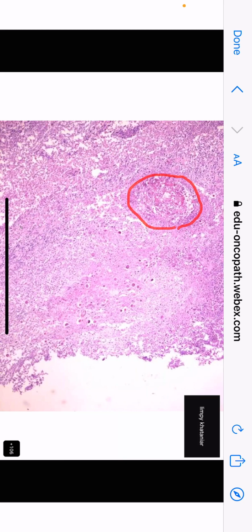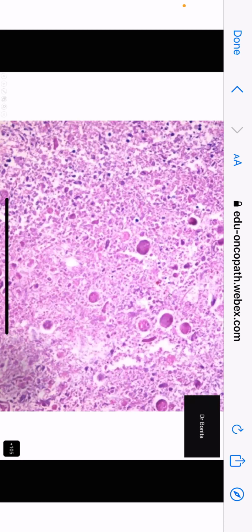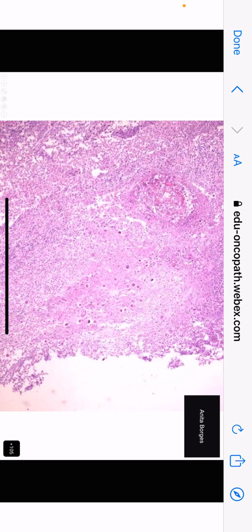Limpy, can you see that I marked something? What is that thing that I marked? You saw the trophozoites, yes. I can see them. But what is this structure? Eosinophilic slender material, like parasites. Can you describe that, Limpy? No, ma'am. All right, let's try.